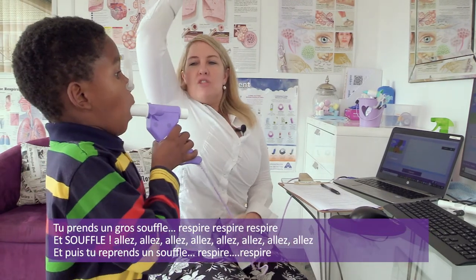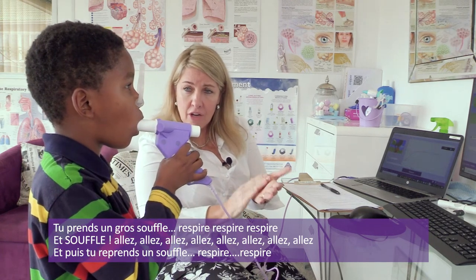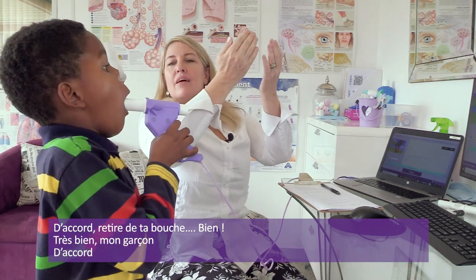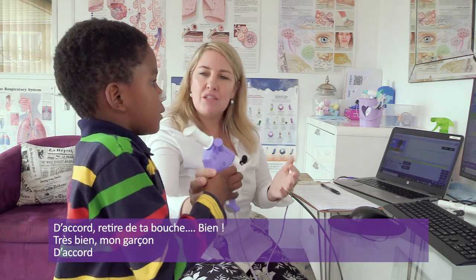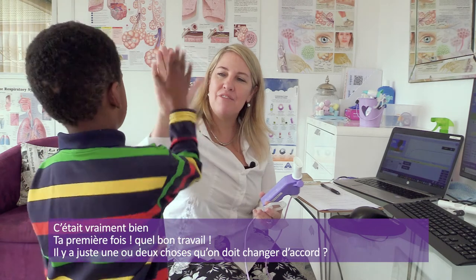Okay, Riley, let's go. Okay, take a deep breath in. Fast. Go, go, go, go! And breathe in, breathe in. Okay, and rest. Take it out your mouth. Well done, my boy. Well done. Give me five. Good first try.